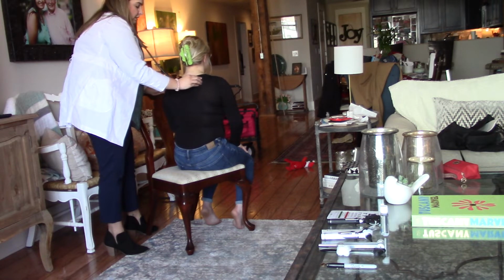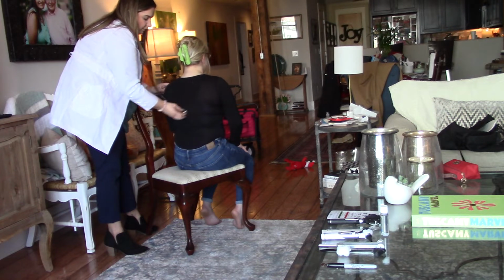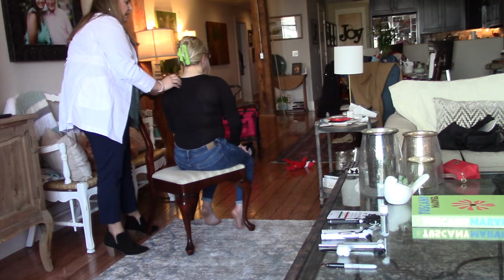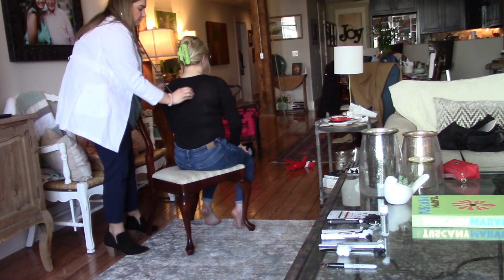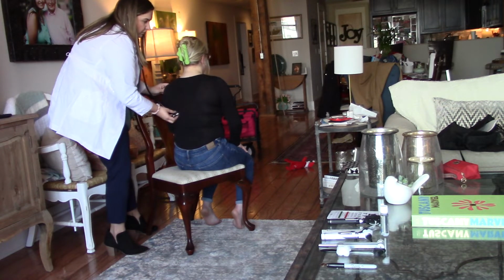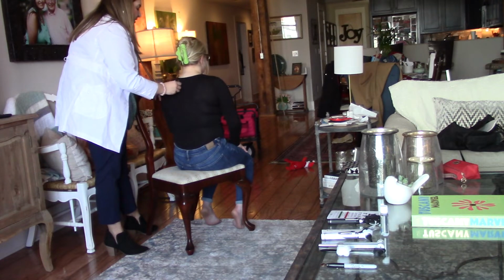E-E-E, E-E-E. Great. And now I'm going to do bronchophony. If you'll say 99 every time I move my stethoscope. 99, 99, 99. Great. And now I'm going to do whispered pectoriloquy. If you'll whisper 1, 2, 3 every time I move.